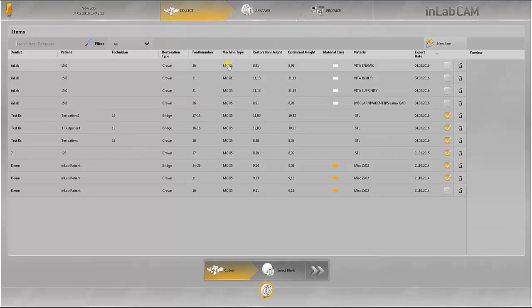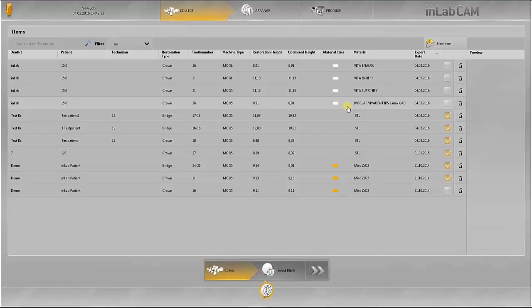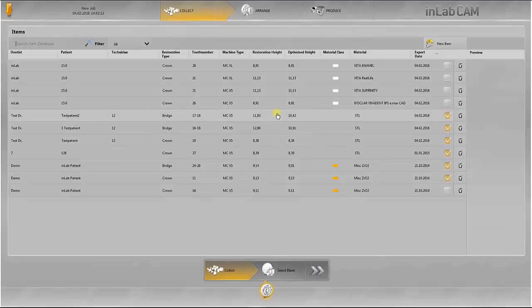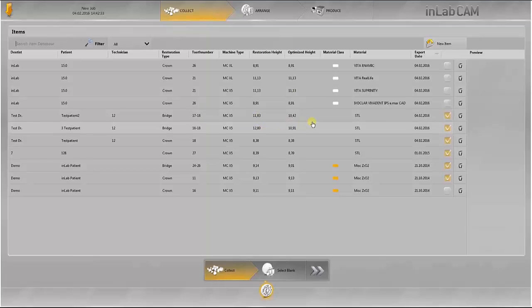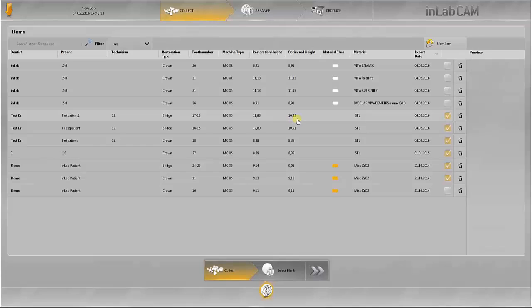You can see how the restoration is optimized by the software at all times. The optimizations are performed automatically. For example, here you can see a restoration with a height of 11.83, which was optimized to a height of 10.42.